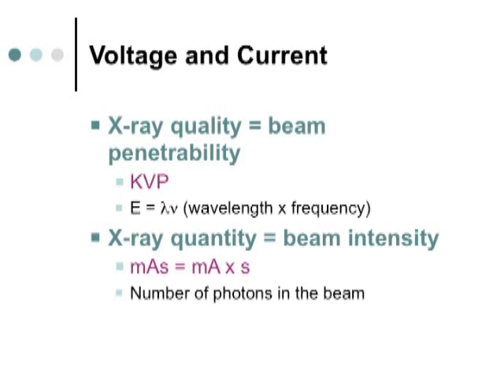If I was going to do a mammogram on a woman, I wouldn't use the same kilovoltage as I would for a chest X-ray or for an abdomen. For a mammogram, I would use anywhere between 20 and 30 kVp. Why? That's a very soft beam. For a chest X-ray, we use 110 to 125 kVp, more penetrating.